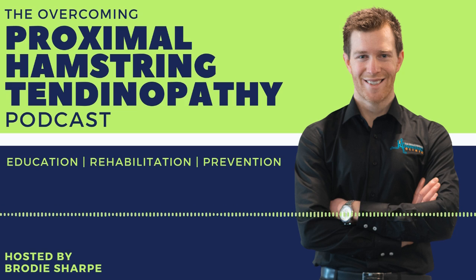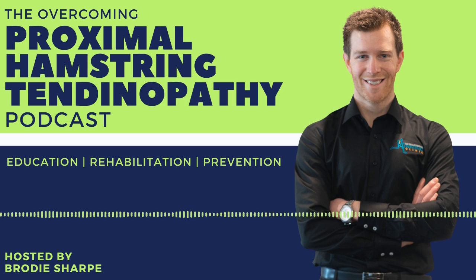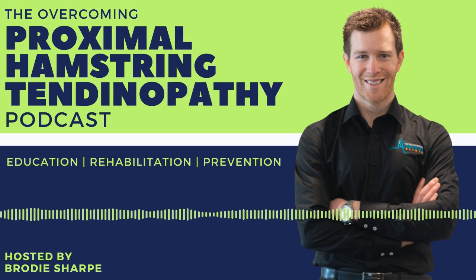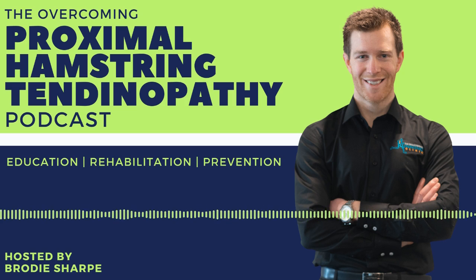So anything which looks not right: inflamed skin, swollen joints, a swollen calf, an acute injury. I don't think there's much scope for shockwave. In fact, I would say it's not really good practice to do that. You could look into other modalities rather than giving shockwave. Yeah. And you did mention the chronic patient who's 2 years down the track might respond quite well.